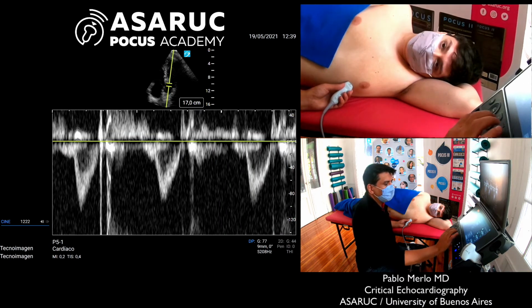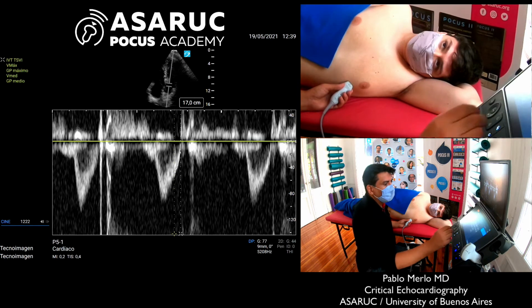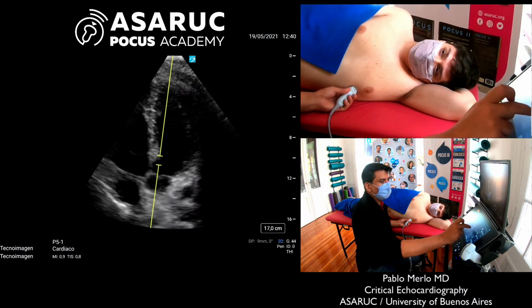This is once more an aortic VTI tracer envelope, but in this case, we're testing the device's automated VTI measurement instrument. When the signal spectrum is sharp, the result of the automated measurement is very similar to what we may do manually.